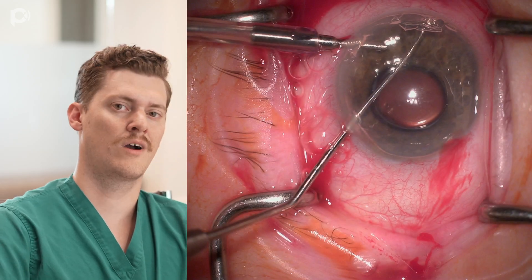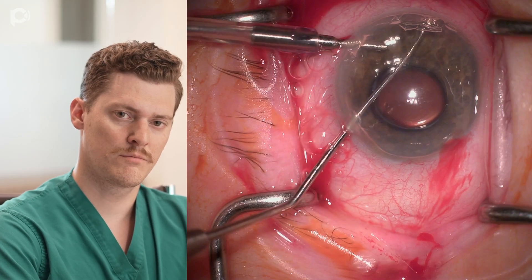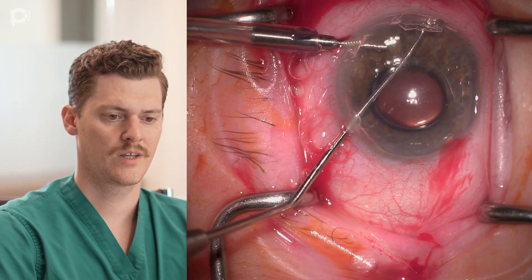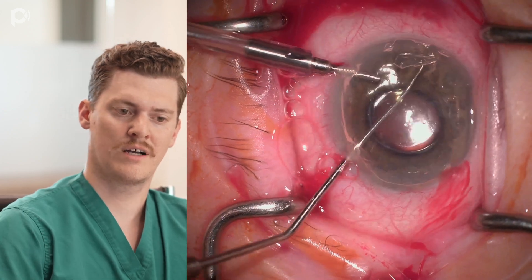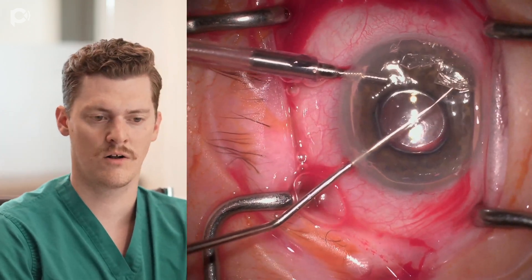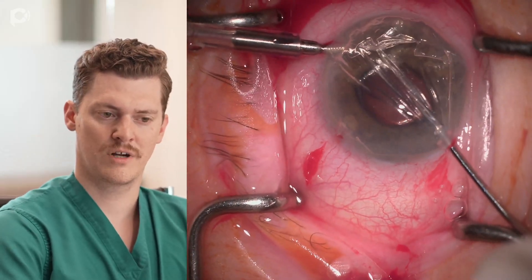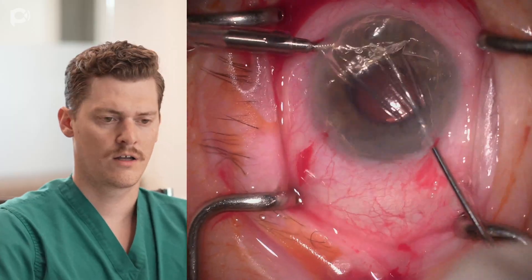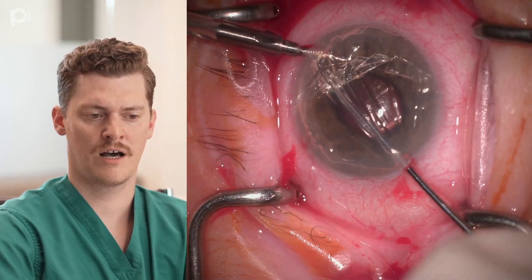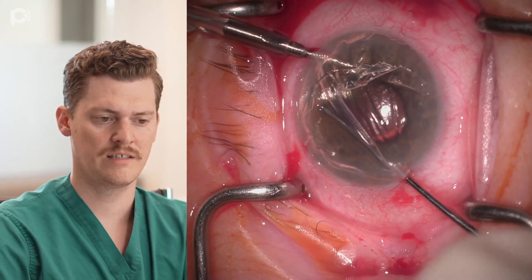During this scoring process, it's paramount that you go further out into the periphery than you anticipate. Near the limbus, you want to go behind each of the wounds and behind the AC maintainer. During the stripping process, you start peeling it — this process is more gentle than I anticipated as well. It's really just peeling it away as opposed to trying to score or strip it off. You want to make sure this comes off in one piece, because if it starts to peel off in multiple pieces, keeping up with them and leaving little fragments is very easy to do.